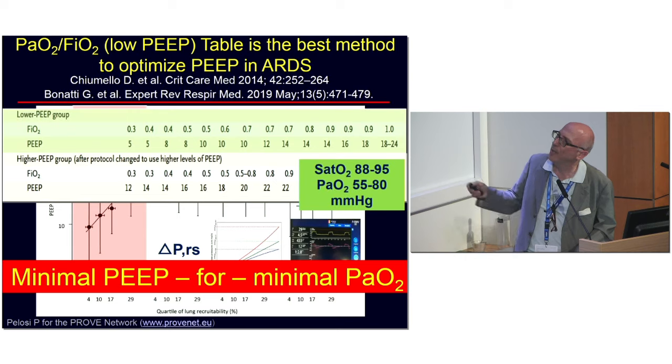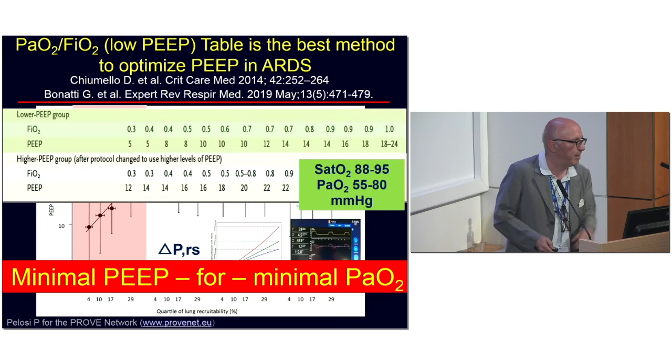So this is my suggestion, again, that will be discussed later: minimal PEEP for minimal oxygenation, the best way to set PEEP. Not transpulmonary pressure, not driving pressure.